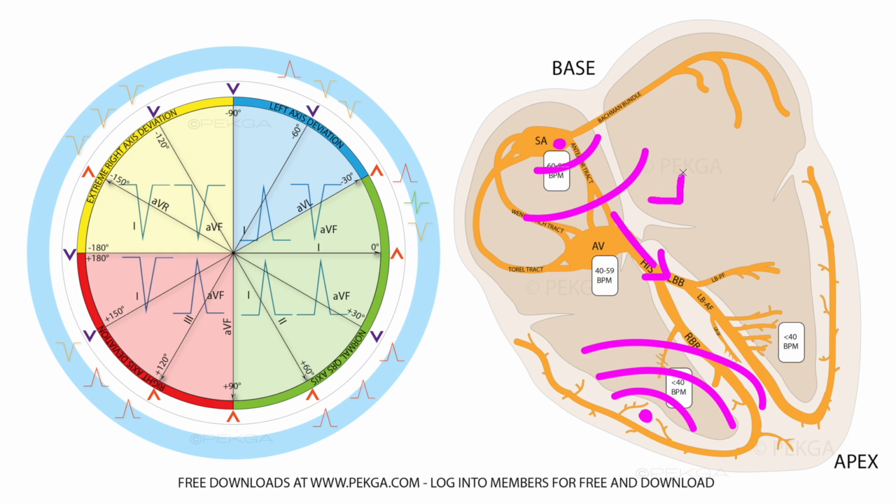So the atrial signal gets through, starts depolarizing the ventricles, and then the signal from the ventricles also shows up. So the ventricles are being depolarized from two sides. One is from the atrium, and the other is from the irritated focus in the ventricle. The signal that starts coming down normally suddenly has an addition of this weird ventricular episode, and you get this fusion beat. You get a combination of a regular beat and a ventricular beat, a regular beat and a PVC, if that helps you imagine it, although we're not dealing with PVCs here.